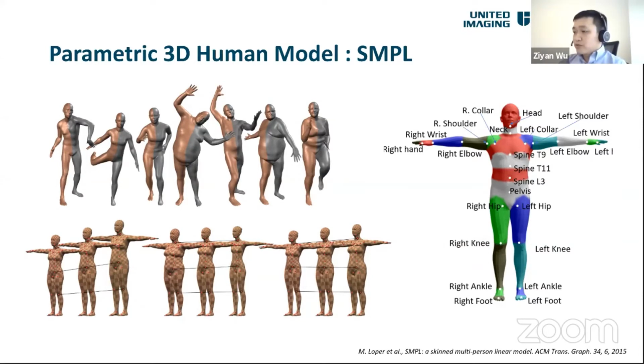And also from the model, we can derive a list of anatomical landmarks. And this is not essentially a limitation of this model, because we can always define new anatomical landmarks based on specific application needs from the mesh model, because we have the full 3D mesh model of the patient.